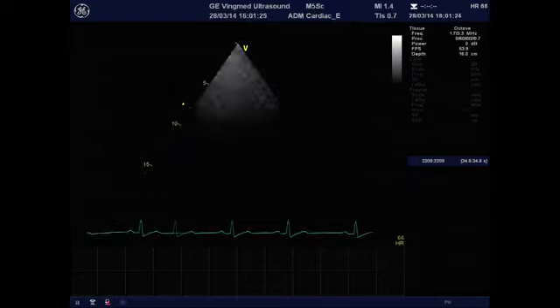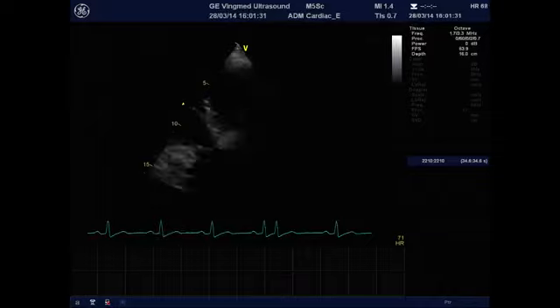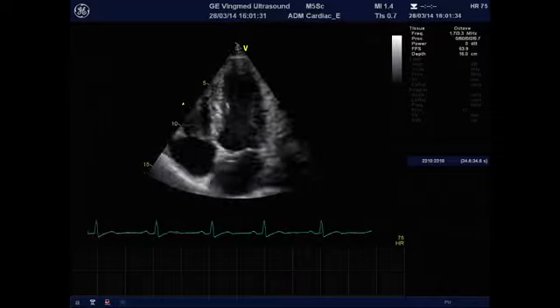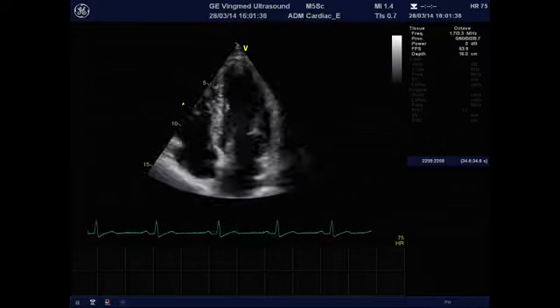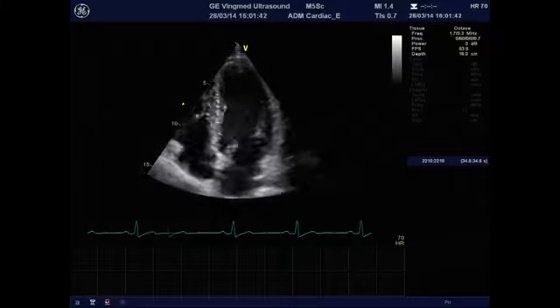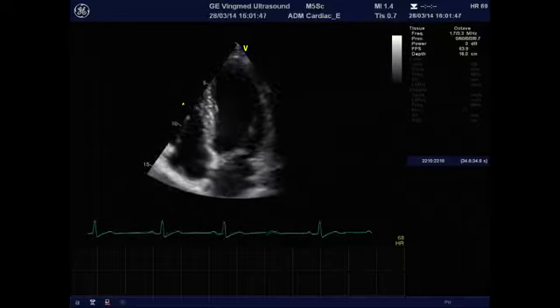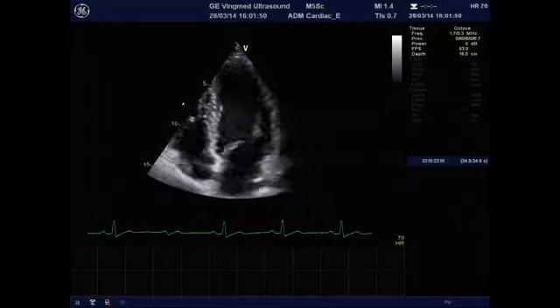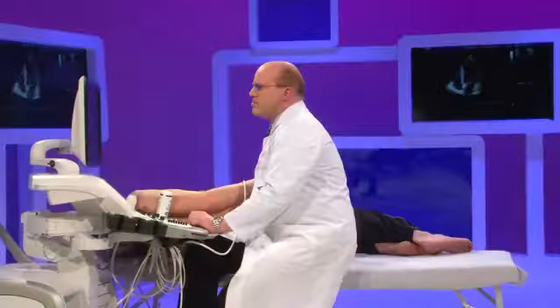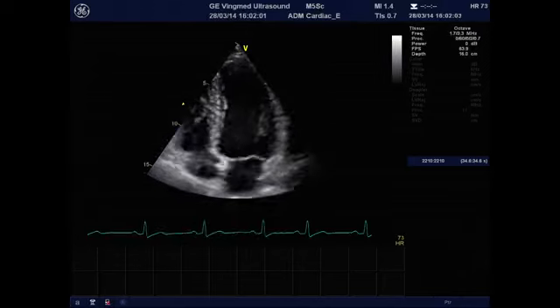Otherwise, it's nothing special what you have to do. Since tissue Doppler is a technique that is one-dimensional, we usually acquire apical images. And when we do so, we are able to measure longitudinal function of the myocardium in all segments of the left ventricle. Therefore, we are looking for a good apical view for the 4-chamber view, the 3-chamber view, and the 2-chamber view. Tissue Doppler is a technique which offers a very high temporal resolution. To take advantage of that, we have to optimize the images.